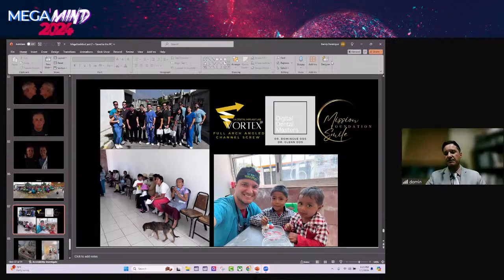For this, we do all that planning initially. I don't decide that after the implants have integrated. I actually decide that preoperatively. For her particular case, through that big workup, the amount of volume that we needed to create for her was going to have to be 17 millimeters. We're going to have an FP3.